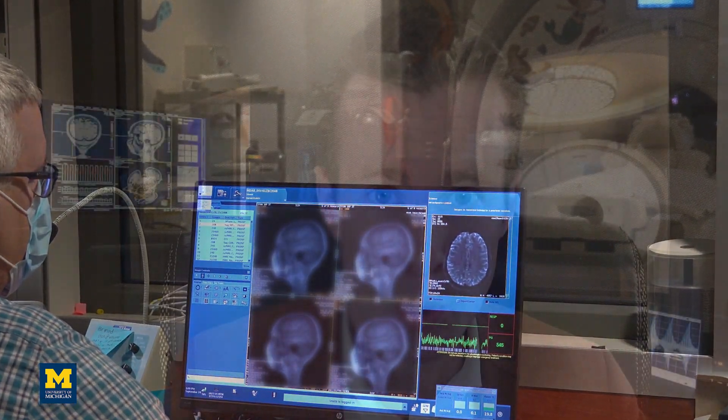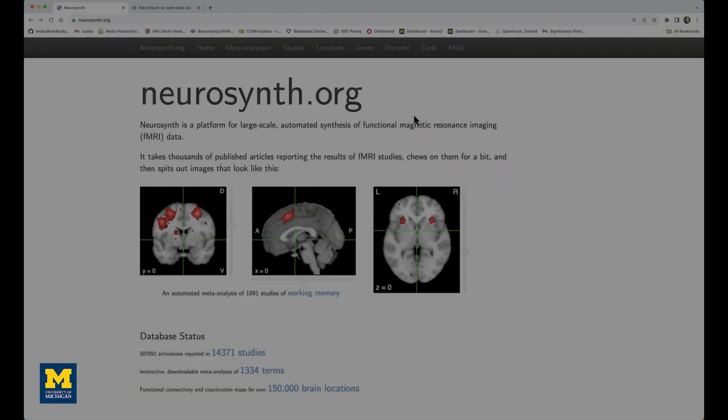With decoding, on the other hand, we're presented with an overall brain map of activation and then we try to make some kind of inference about what the subject was doing or thinking at that time.